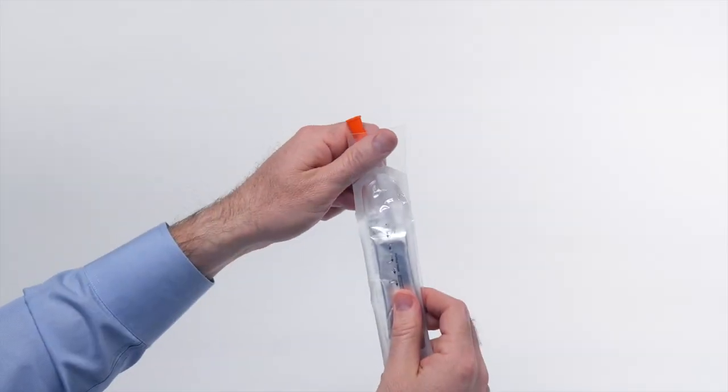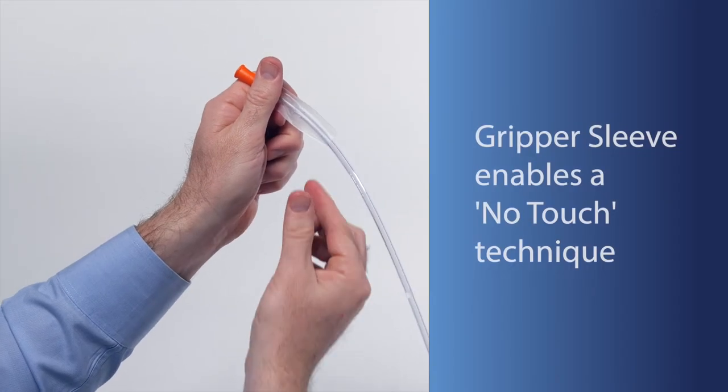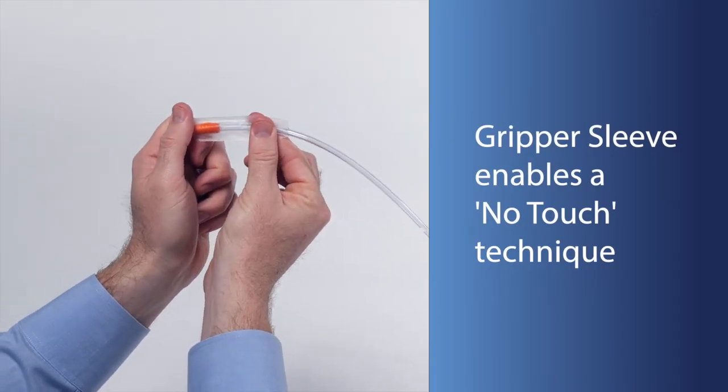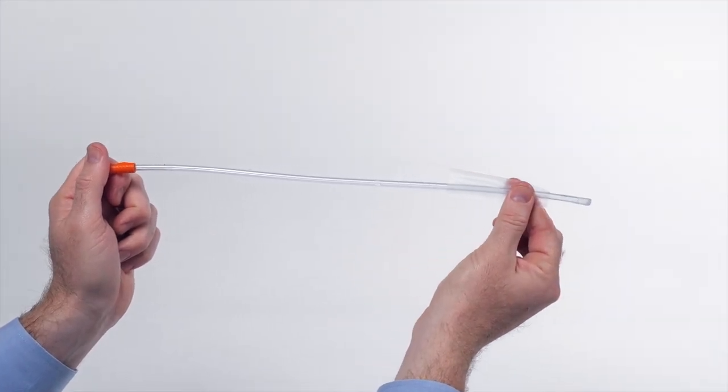With clean hands, remove the catheter from the package by the funnel end. A gripper sleeve prevents direct contact with the catheter for controlled, clean use and reduces risk of exposure to bacteria that can lead to infection.